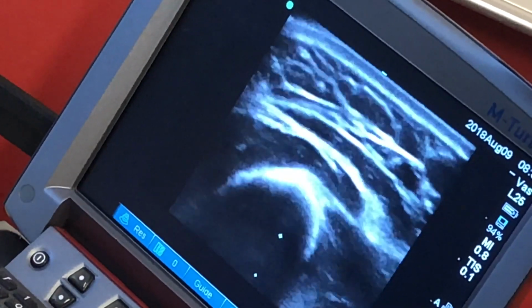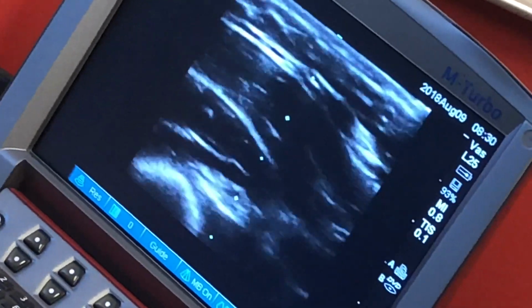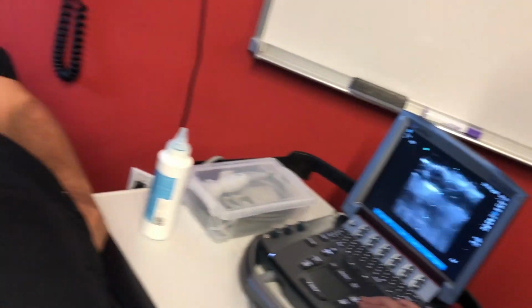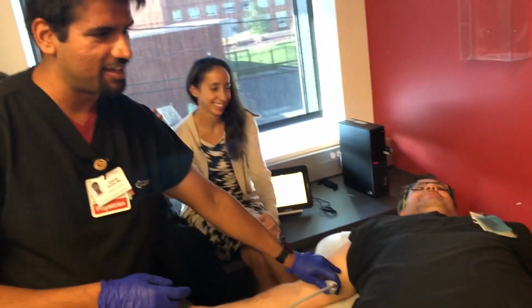And as you can see, based on how little pressure I'm putting, the tiniest amount of pressure will completely collapse it, so you have to be careful. Obviously, this is currently untourniqueted. So this is one of the first places that I will look, because the forearm will preserve your higher vasculature for later access. The second place you can look is up in the axillary.